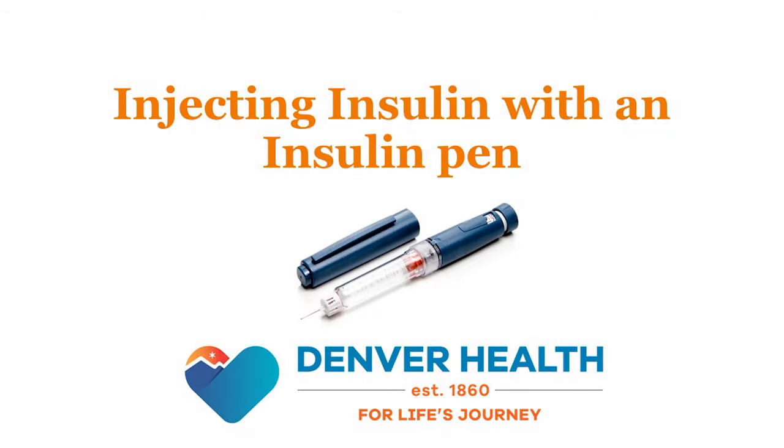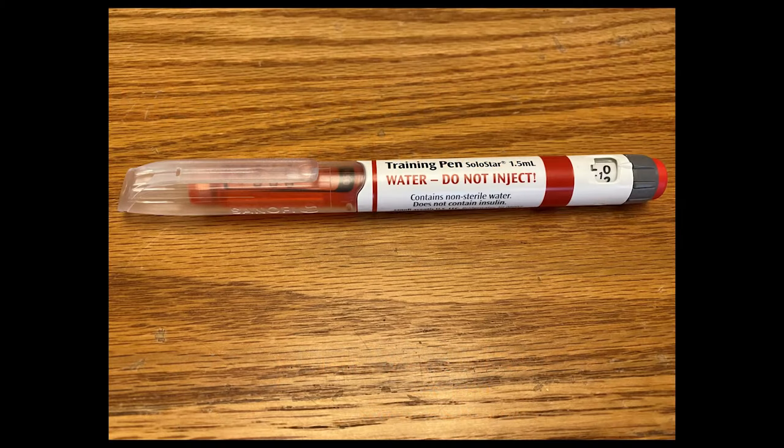In this video, we'll be demonstrating the correct technique for injecting insulin using an insulin pen. But first, let's review the parts of an insulin pen.